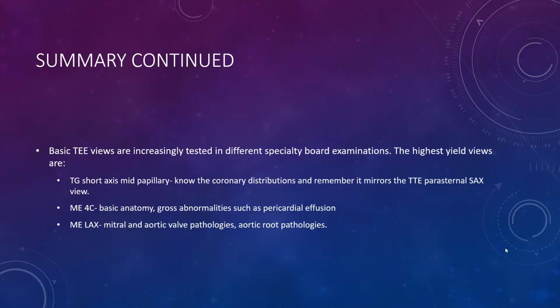In addition to these three views, the view that resuscitative TEE recommends as another high-yield view is going to be that mid-esophageal bicaval view. And then the other ones that I would add that I think can be very useful in diagnosing aortic pathologies and pleural effusions are the descending aorta short axis, as well as the ascending aorta short axis.